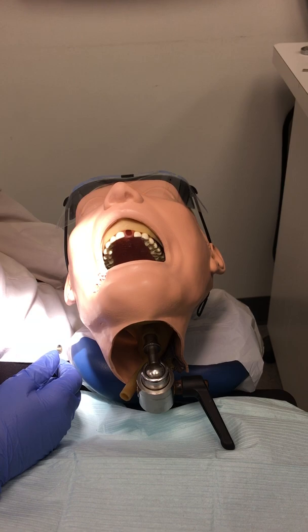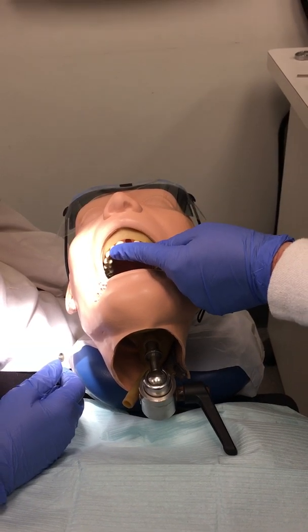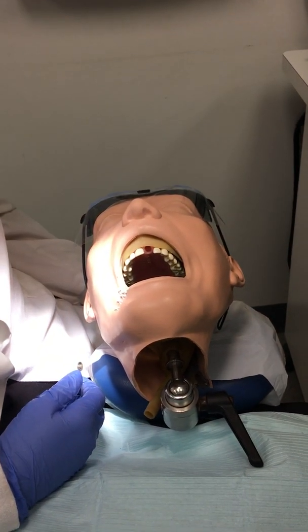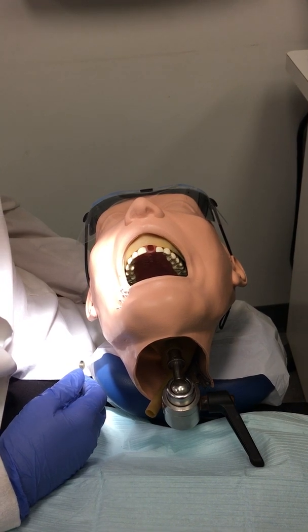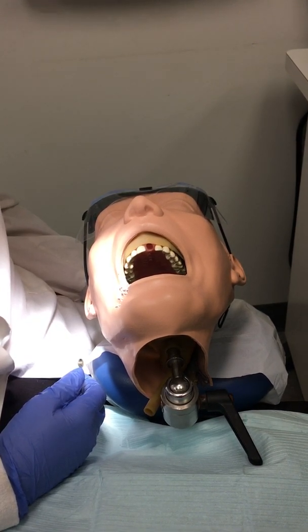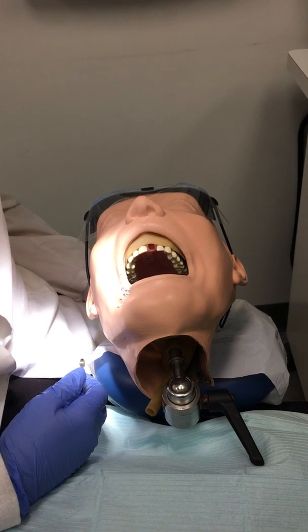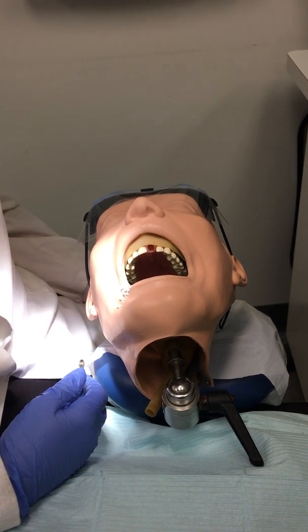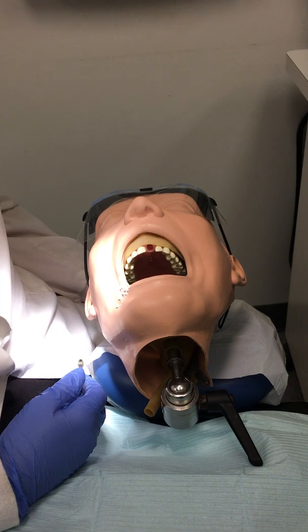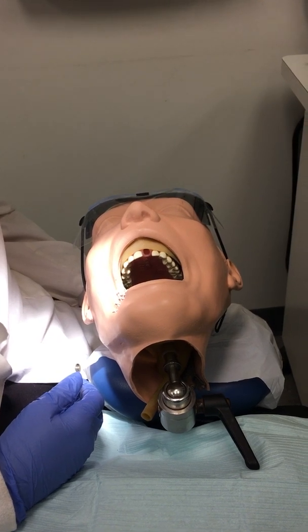Mr. Dexter, we're going to do a root canal on your front tooth here on your top arch. We will be getting that completed today. I wanted to check with you to see if you've had any changes in your medical history or any new medications. I also need you to sign this consent form allowing us to do this procedure for you.